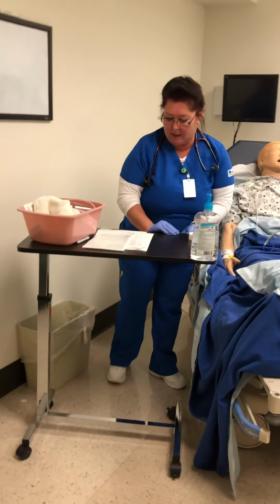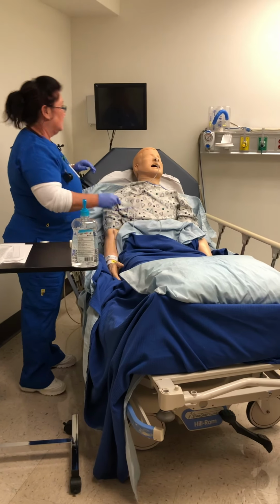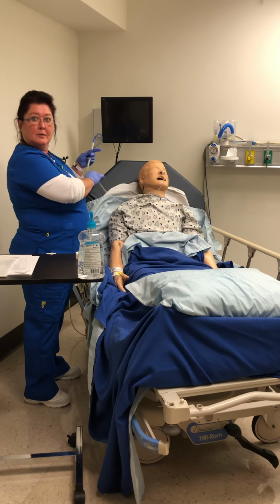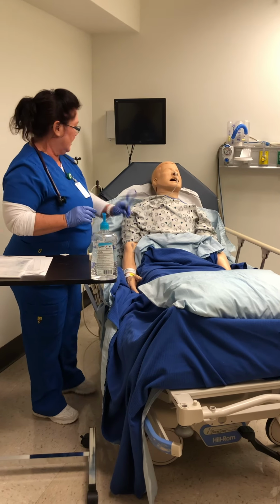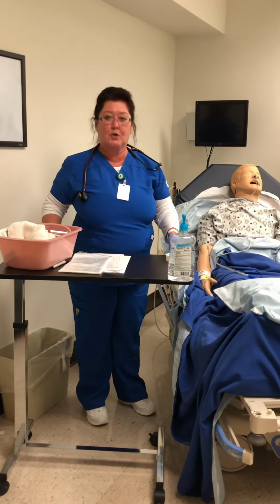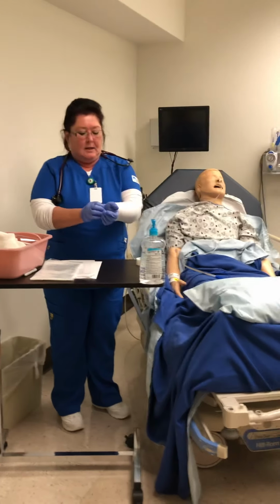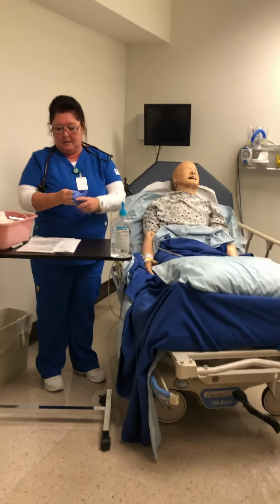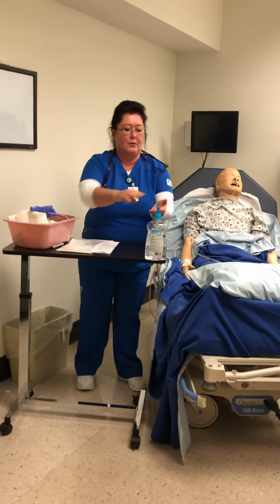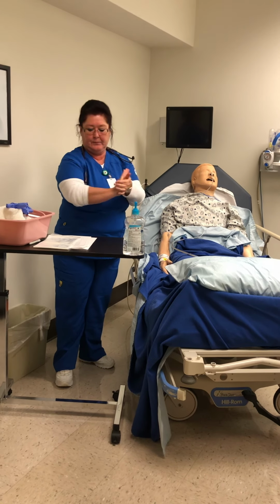Okay, so I am now going to hook her tube to the suction and low suction, and I am going to clean everything up. I have called an x-ray to come down and take an x-ray to make sure that the tube is placed correctly. Taking off my gloves, aftercare of the room, hand hygiene, and Shirley, I will be back to see you shortly.